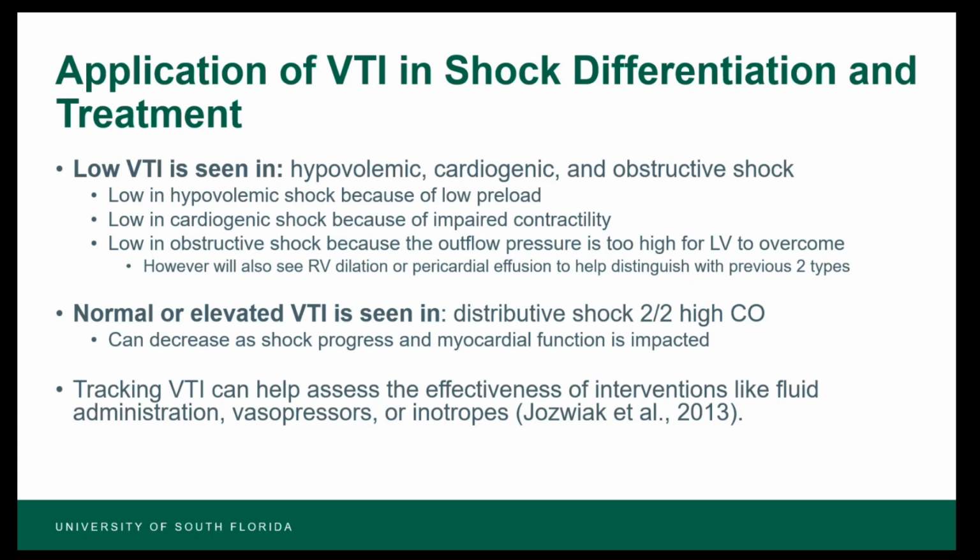On the contrary, you can also see normal or elevated VTI in the setting of shock. That's usually in a setting of a distributive shock.